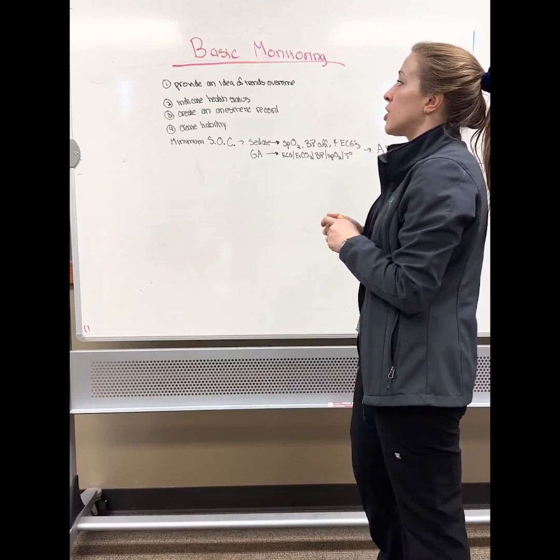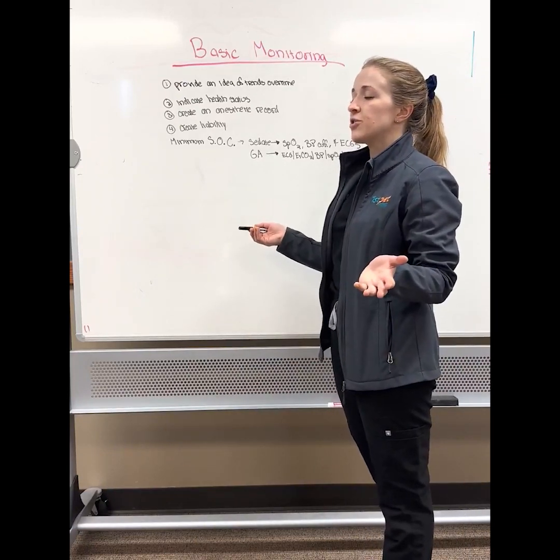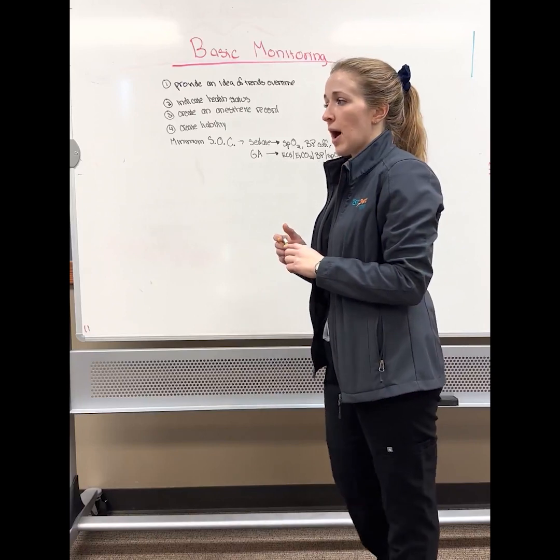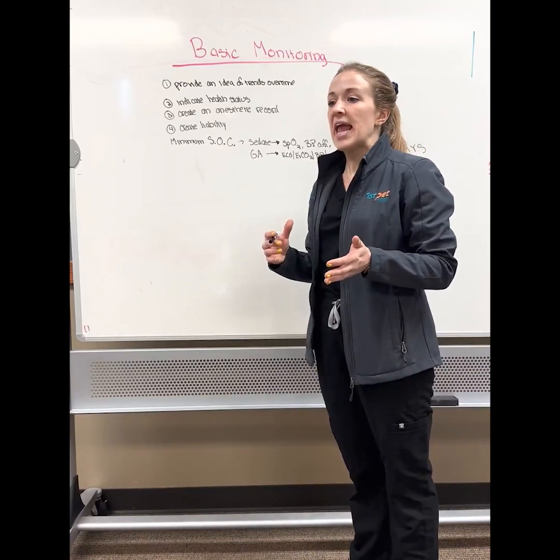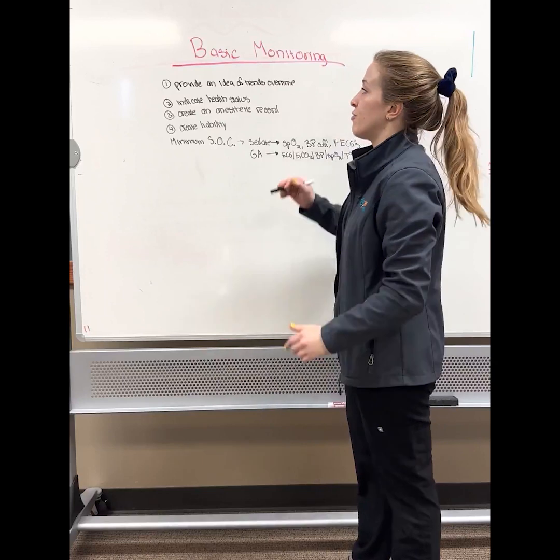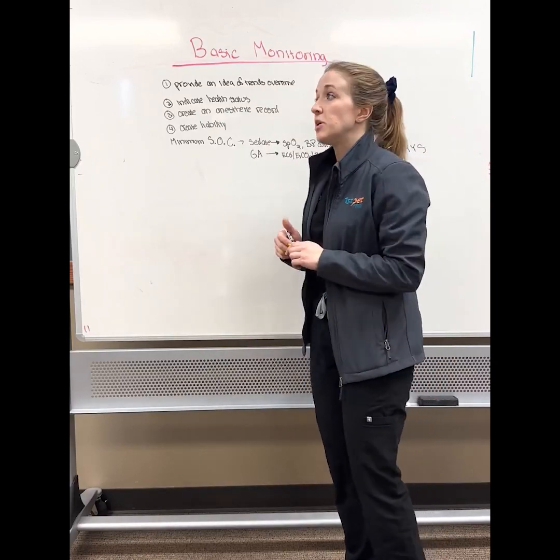So today I want to talk a little bit about why we monitor animals when they're sedated or anesthetized. I'll talk about the different types of equipment that we use for that and some of the basic technology behind how they work. Now, specifics on troubleshooting, monitoring, and advanced technology of these modalities, I will discuss at a later point, and we will also discuss how to fix those problems. But today we're just going to focus on how they work and why we use them.